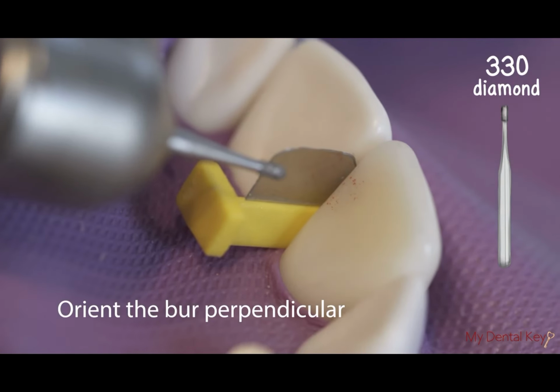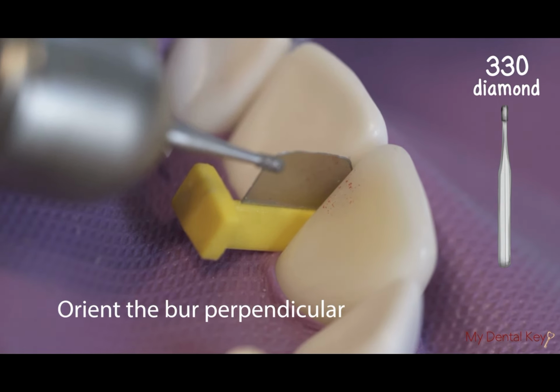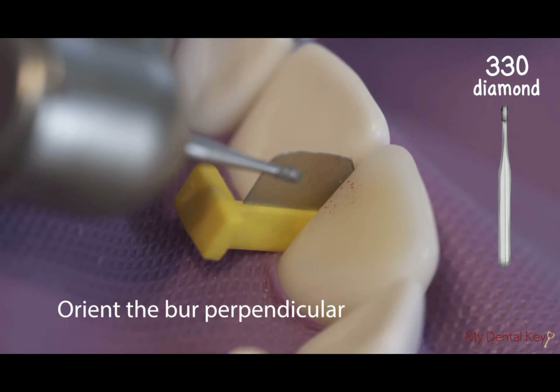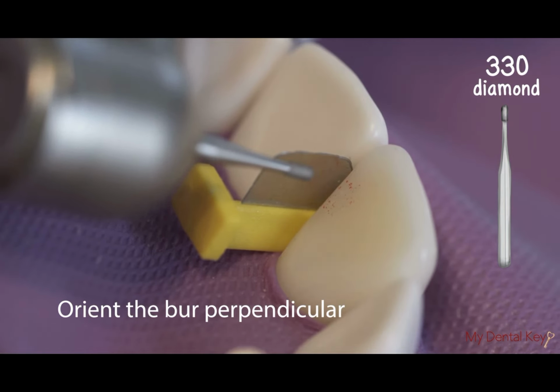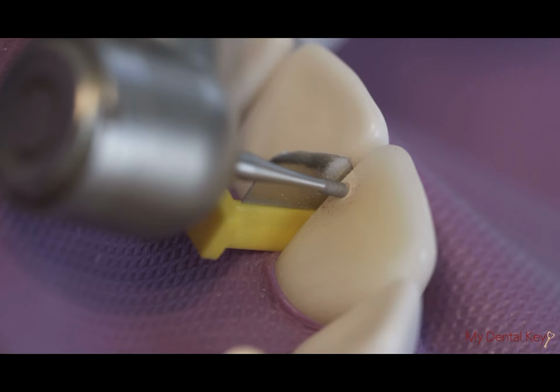After separating the contact areas, orient the burr perpendicular to the lingual surface of the tooth over the carious lesion. Place the burr close to, but without touching, the adjacent tooth. Here, we are using a 330 diamond burr. Our team chose to use the 330 diamond burr because it works well with the simulated enamel. The carbide burr is switched in when we are drilling in dentin.